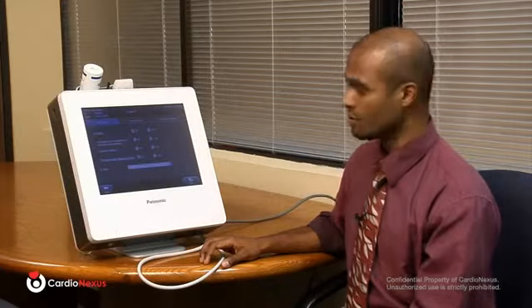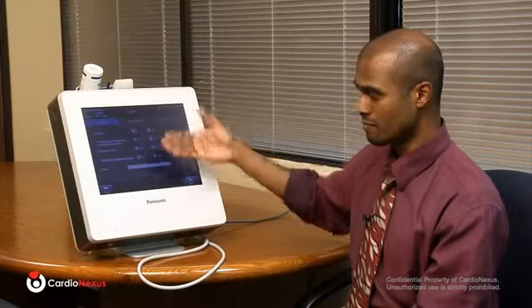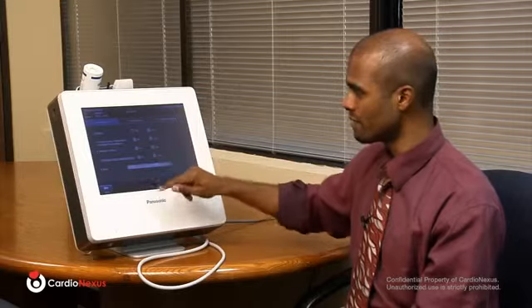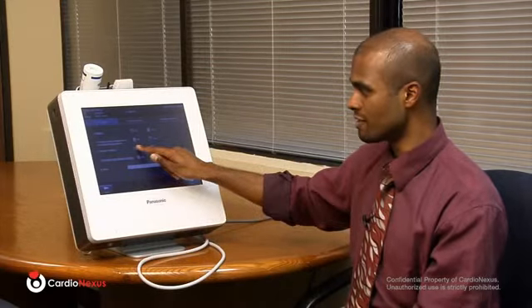Now, the CardioHealth station does calculate a Framingham risk score, so it's a traditional risk factor assessment. For that, we do require certain questions be answered regarding the patient. So just simply ask the patient about the questions here and then just choose their answer as they answer. So, smoker, yes or no? Are they currently on high blood pressure medication, yes or no? Do they have diabetes, yes or no? And is there a history of premature heart disease in the family?